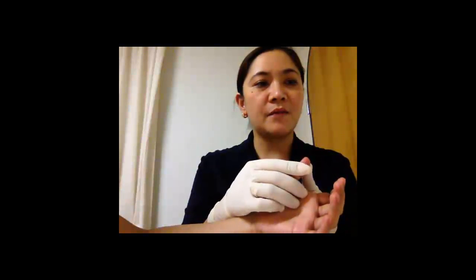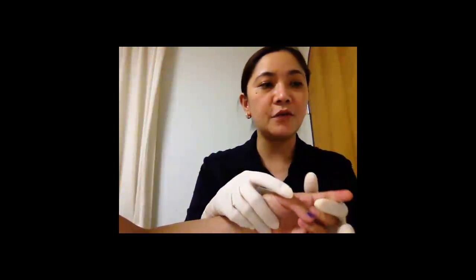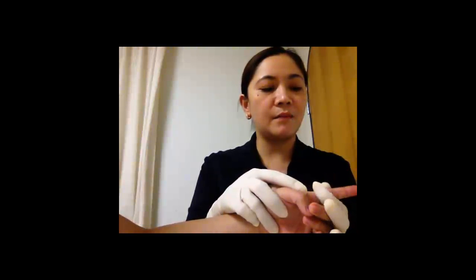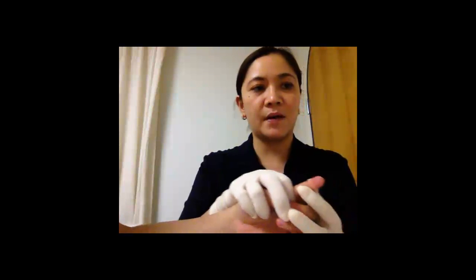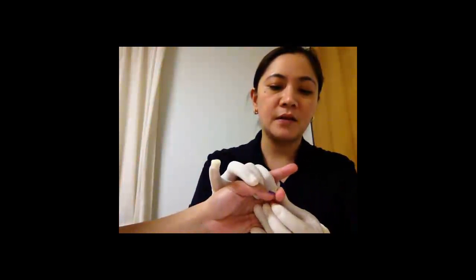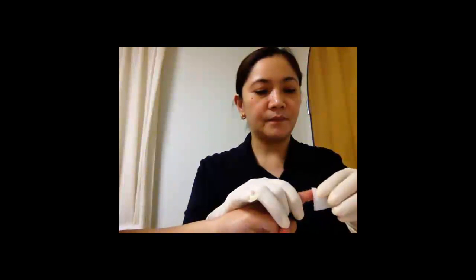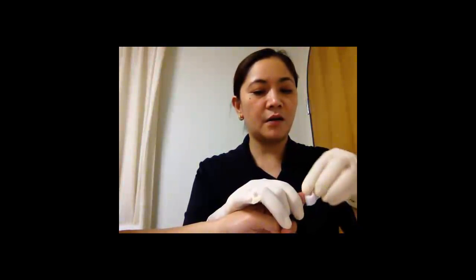We can use any fingers of the patient, but make sure that you are going to prick the lateral side of the finger because it is less painful than the middle part. Before you prick the finger, massage or squeeze the finger from proximal to distal so that blood will flow to the distal part. I will choose the index finger and slightly massage it so that there will be enough blood supply. After that, cleanse the area or the site of injection in a circular manner. Let the finger dry for some time.